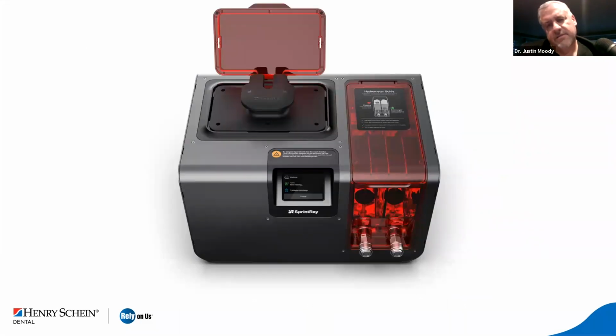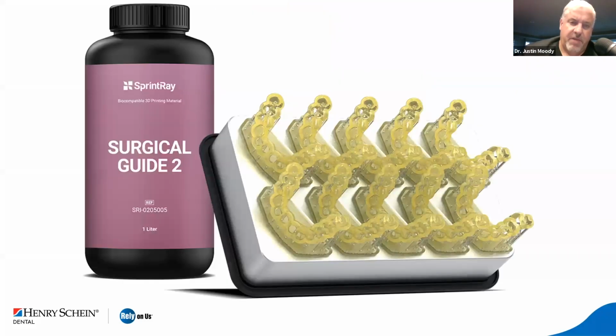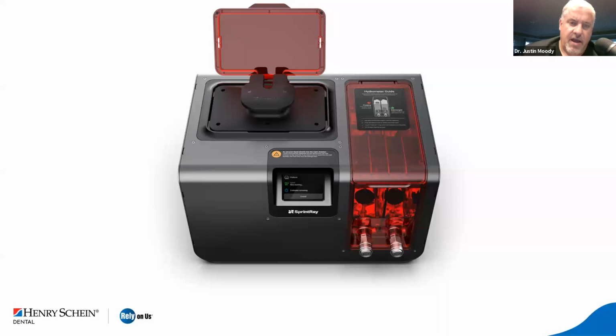And this is one of the coolest things, and I haven't got my hands on this because supposedly it's going to be available in January. But this is the SprintRay Wash and Dry. So you take that build plate like you see here, and you invert it and set it into the wash machine, and it has a washer and a dryer in here, and it starts what we call post-processing automatically.